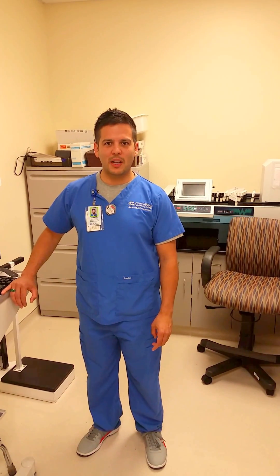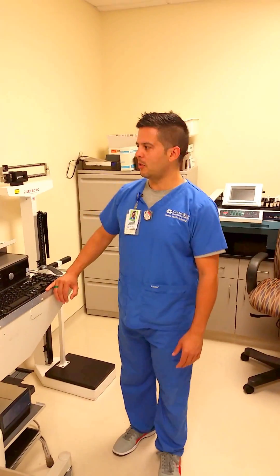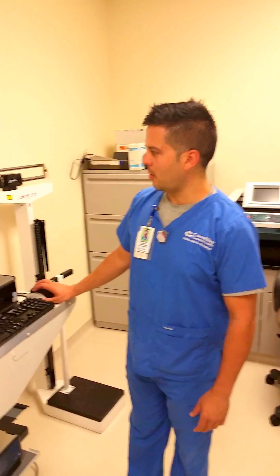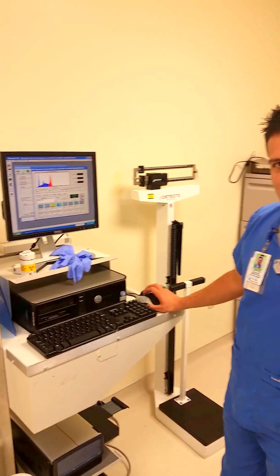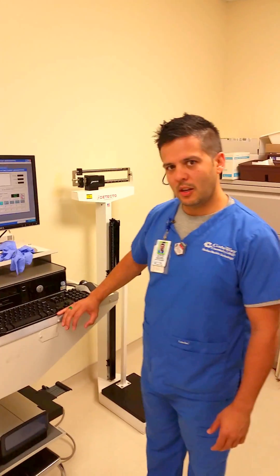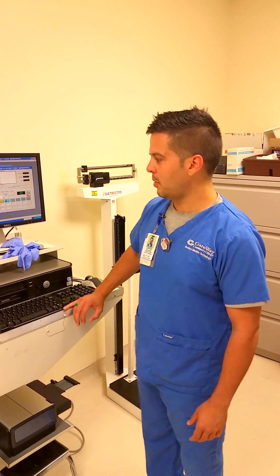David, we're going to do a thyroid uptake and scan today, but we're going to do the thyroid uptake portion first. So I'm going to set up the patient into the computer so that we can do a count — a measurement of how much activity is actually in our iodine-123 capsule pill.